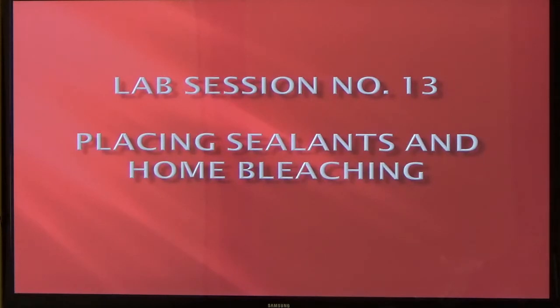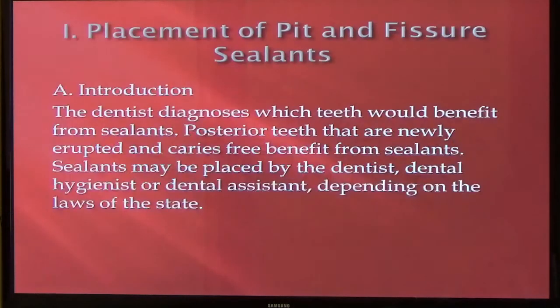So lab session 13. Placement of the pit and fissure sealants, and we've talked about these on the pediatric lecture and even before that.